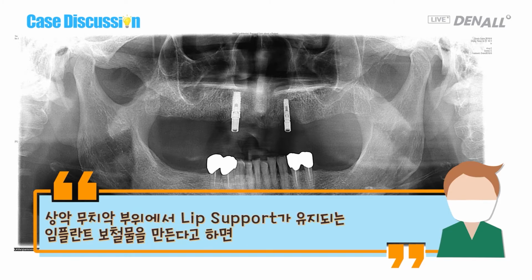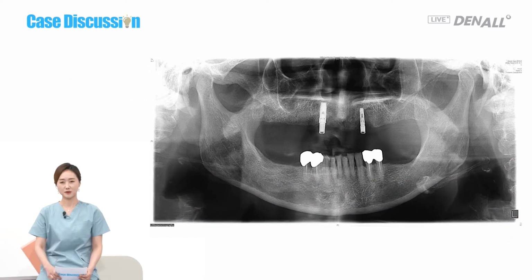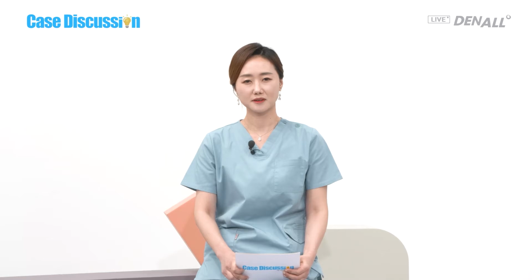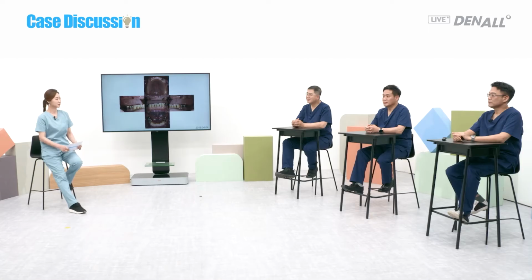To make the implant prosthesis keep the lip support in the upper edentulous area, how can it be done? That is a story from the patient's dentist. Here, 13 and 23 implants are used for the overdenture, and there is a teeth-supported RPD in the mandible. As there is the alveolar ridge in the maxilla, implants can be placed there. Lips are influenced by the teeth and the alveolar ridge. This is very challenging because we need to provide the lip support in the upper edentulous region.